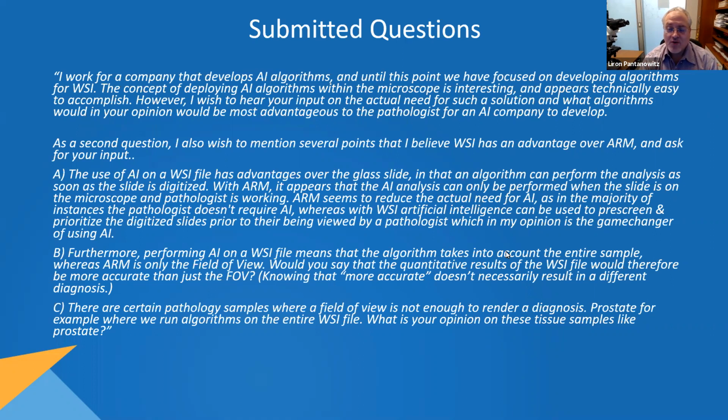I'm also ready to diagnose not just adenocarcinoma, but other features in that case. What if there's background granulomas or something else that's important? So that's why I think AI algorithms for WSI, while they're great, there's a long way for them to go before they replace us. So I think ARM has a great role for coupling the AI with the pathologist and not eliminating us for now.